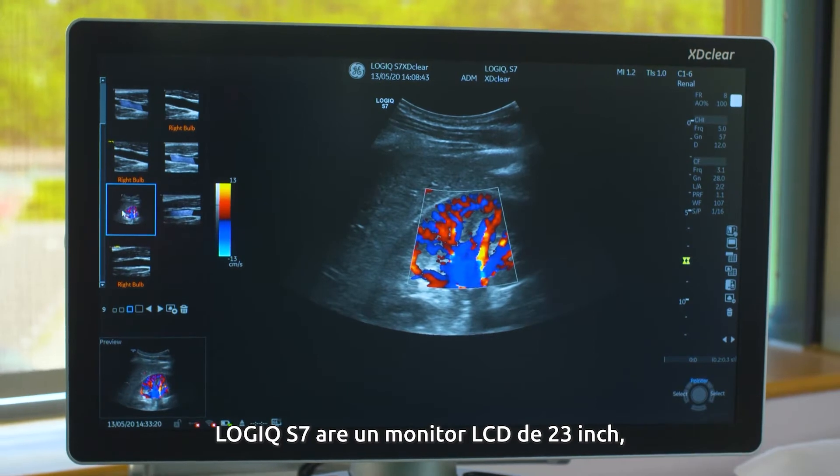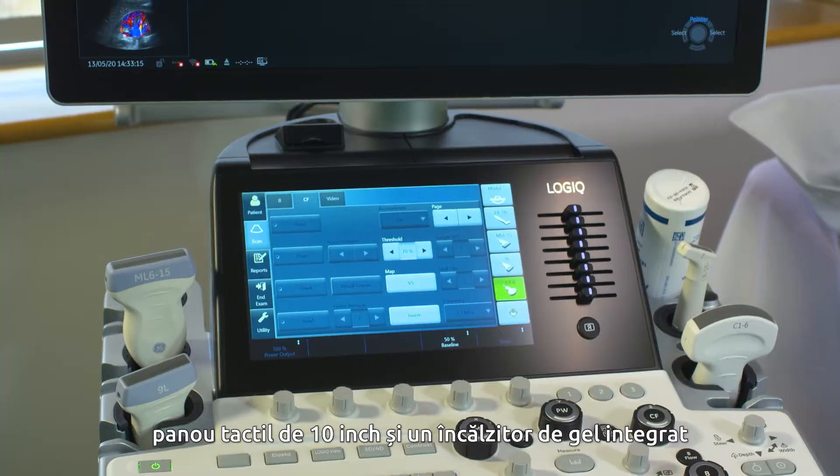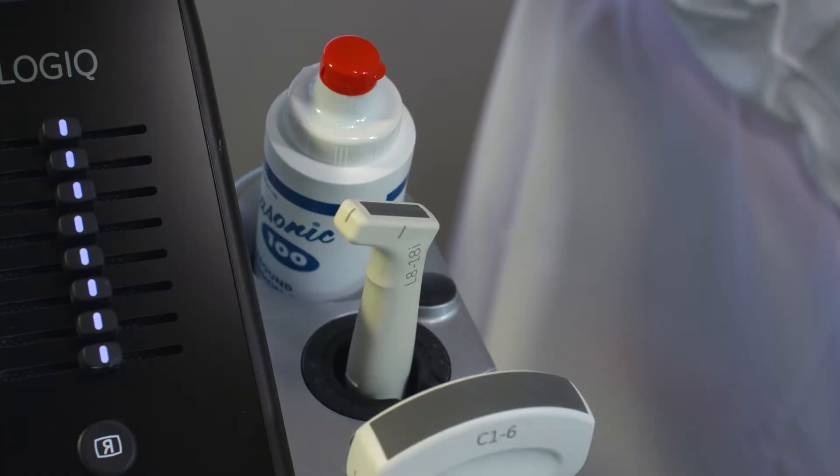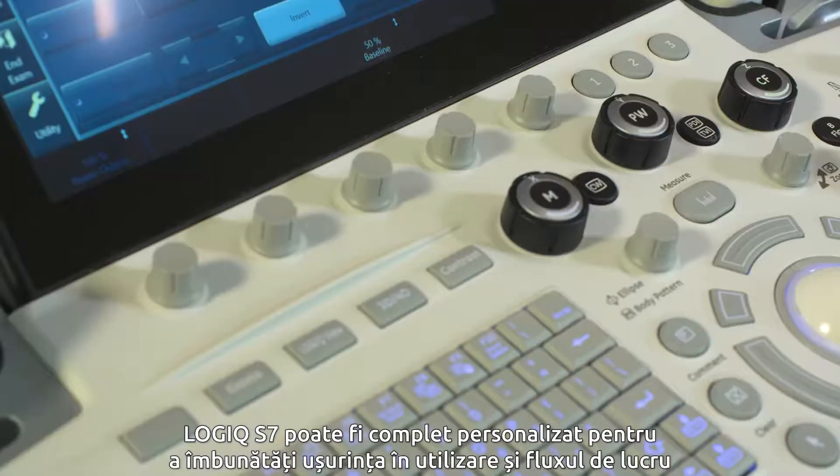The LOGIQ S7 has a 23 inch LCD monitor, 10 inch touch panel and an integrated gel warmer. The LOGIQ S7 can be fully customised to improve the ease of use and workflow.